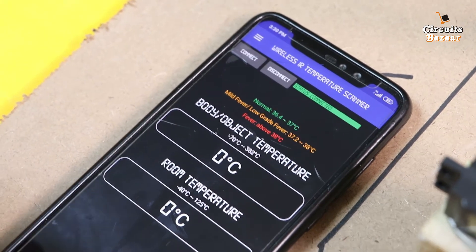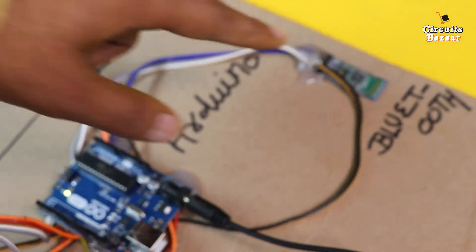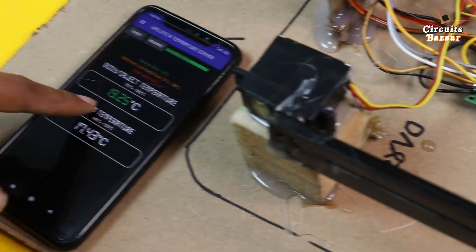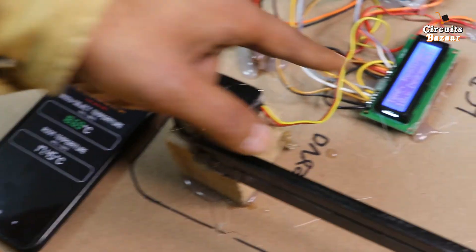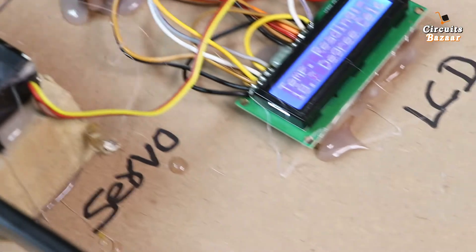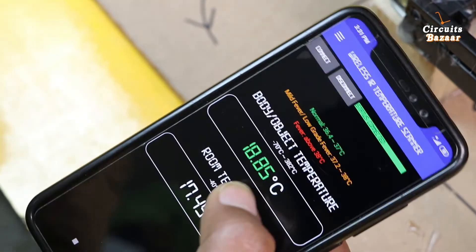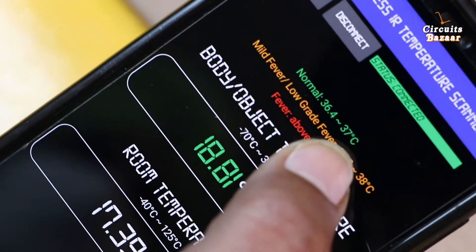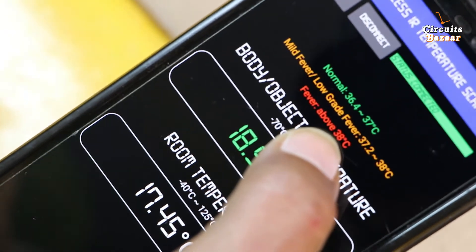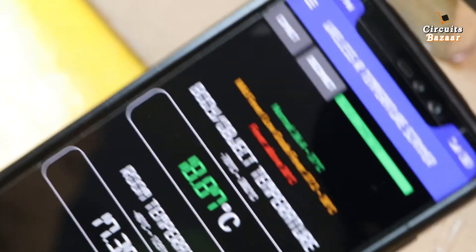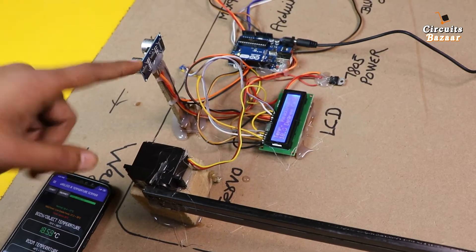Once connected, the Bluetooth module blinks very slowly. You can now see the temperature reading on the mobile phone — 18.65 degrees Celsius — the same reading as on the LCD. The app shows three grades: normal is 36 to 37 degrees Celsius, mild is 37 to 38 degrees Celsius, and above 38 degrees Celsius is shown in red, indicating a danger zone.